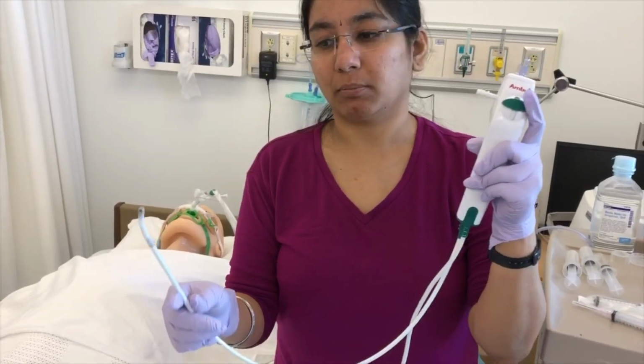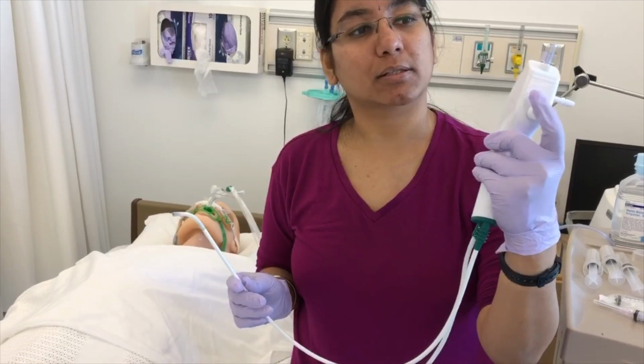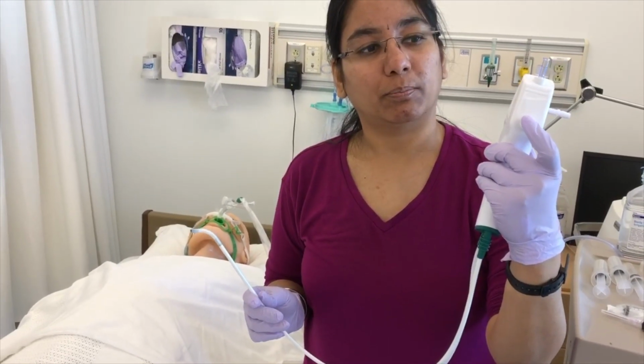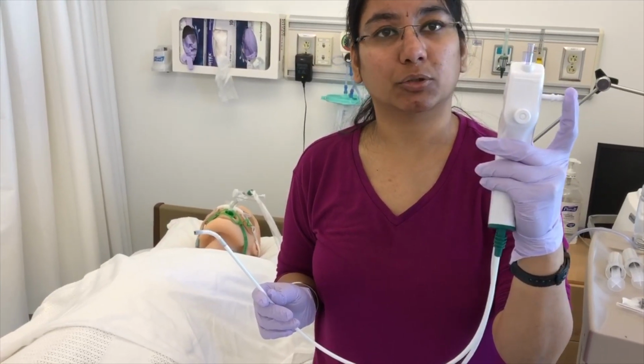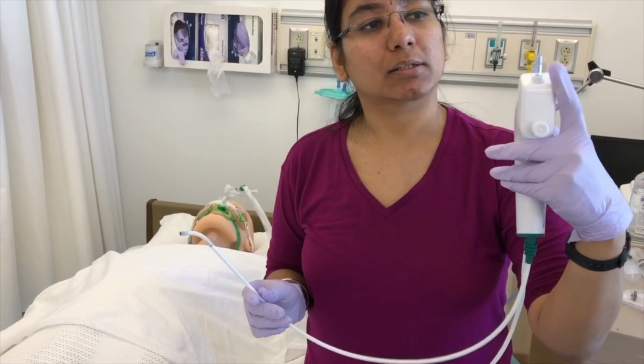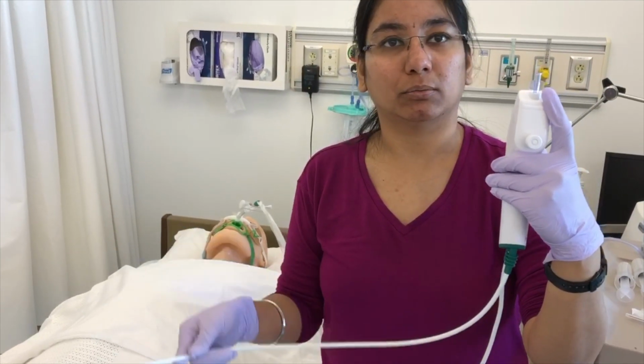So this is the toggle where you can manipulate the bronchoscope, and this is the suction pressure where you can apply the suction pressure while suctioning, and this is the suction port, and this is the insertion port where you can instill saline, drugs or any add-on tools.